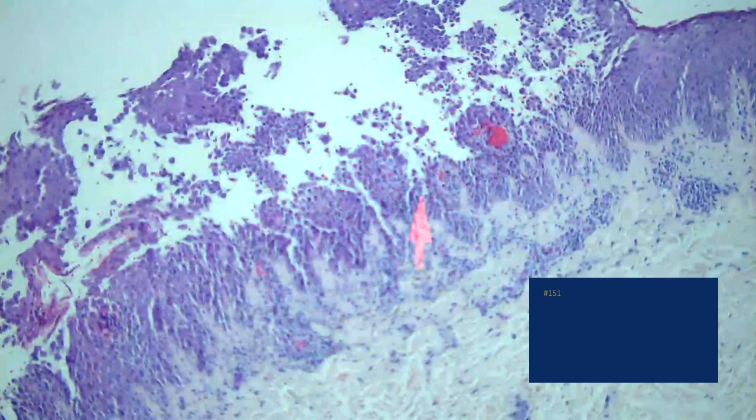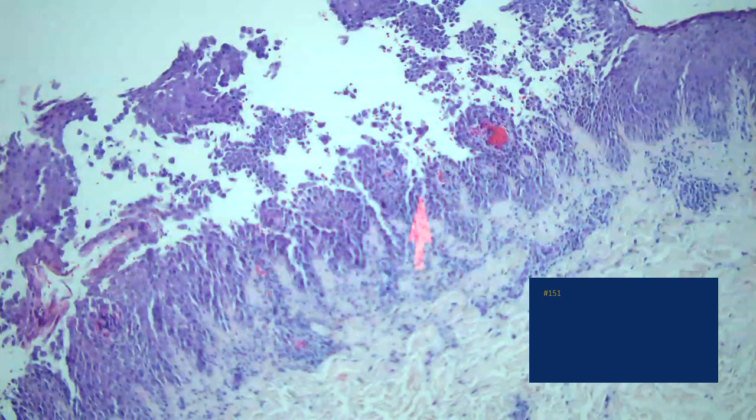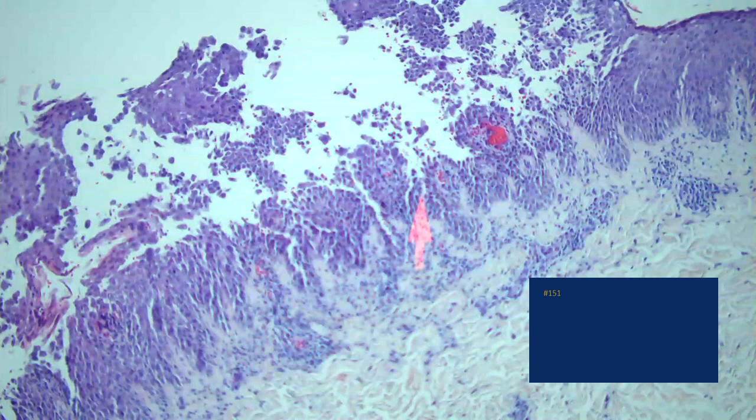So the differential diagnosis of that includes the diseases in the family of Pemphigus. So we have superficial Pemphigus, Pemphigus vulgaris, Hailey-Hailey disease, pseudo-Pemphigus, things like drug-induced Pemphigus, Pemphigus-like Grover's, localized small area of involvement. So we have to decide which of those it is.